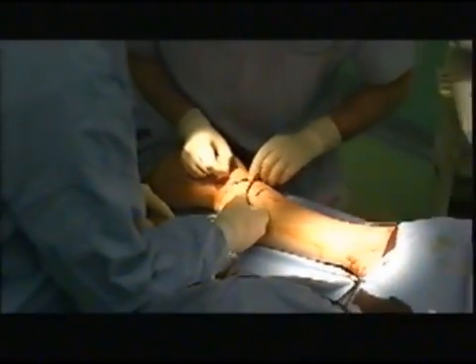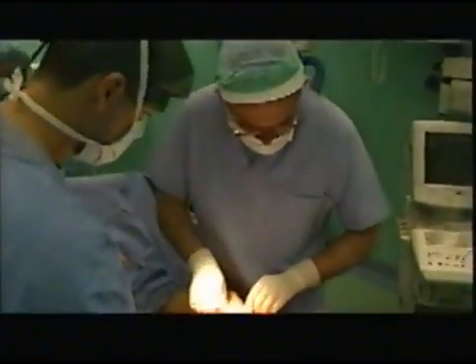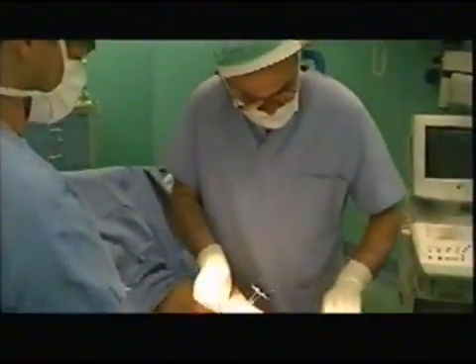The surgeon feels the temperature of the skin covering the fiber optic and the vein segments.